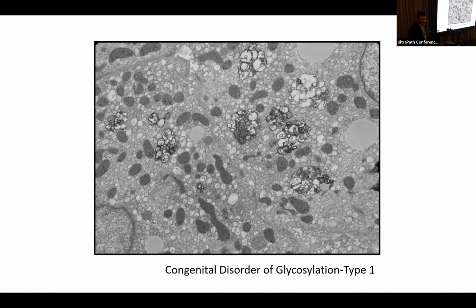The material observed within the cytoplasm of these hepatocytes resembles some of that bile accumulation or focal cytoplasmic necrosis that I showed earlier, which is a fairly common thing to see. This was initially thought to be just bile damage, hepatocyte injury, and was written up that way. Then we learned that the patient wasn't jaundiced.